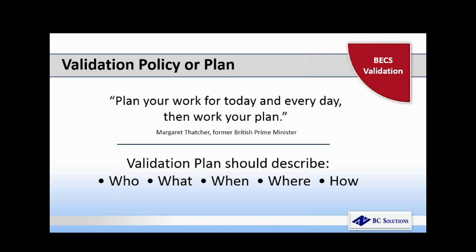You also need to look at the who questions. Who will be responsible for the validation? Who will develop the actual validation scripts? Who will implement them? Who will review the outcome of the validation? Who will have the authority to make the final decision on whether or not you go live with this new or changed system? Who can make changes in the system after the initial validation is performed, and what will happen after that? The validation plan needs to specify the specific person or the position who will be responsible for each of the tasks in the validation.